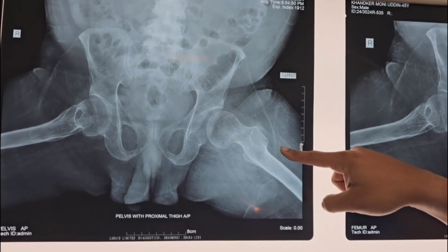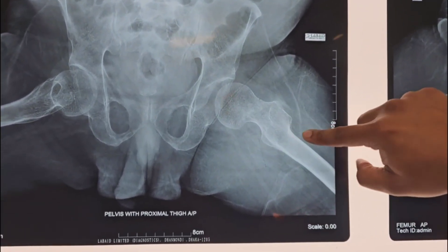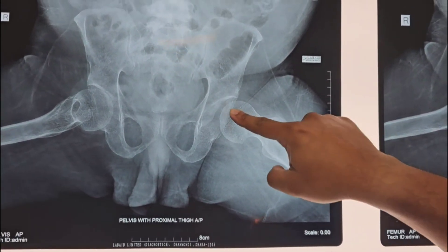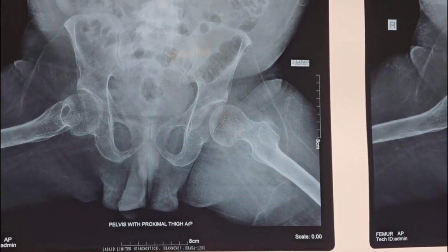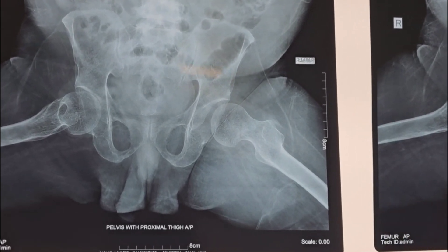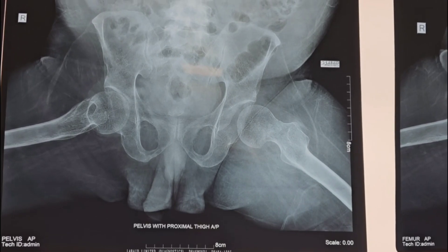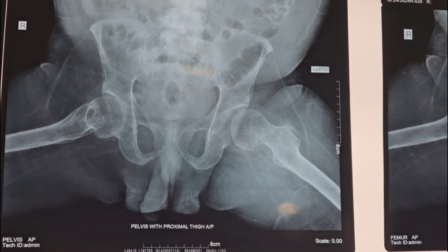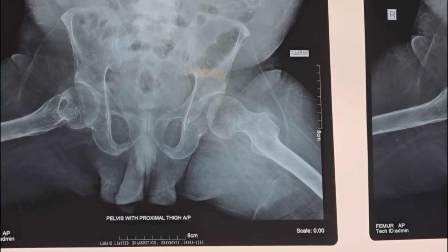We will insert a guide wire from the trochanteric flare into the head — two or three guide wires. Then, following the guidance of the guide wire, we will insert the cannulated hip screw. There will be almost no scar after this operation. We don't even need to incise any skin — we will just stab two or three places. That's it.